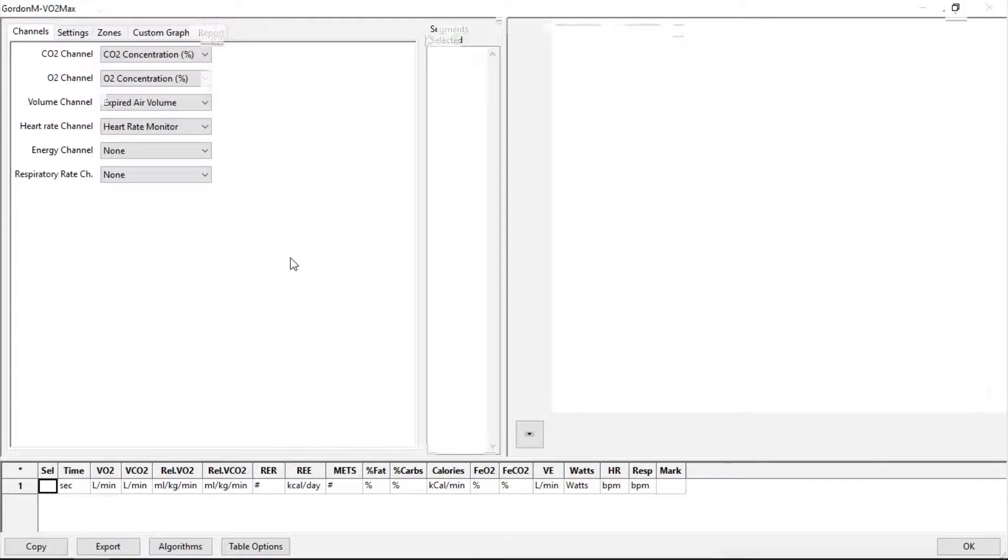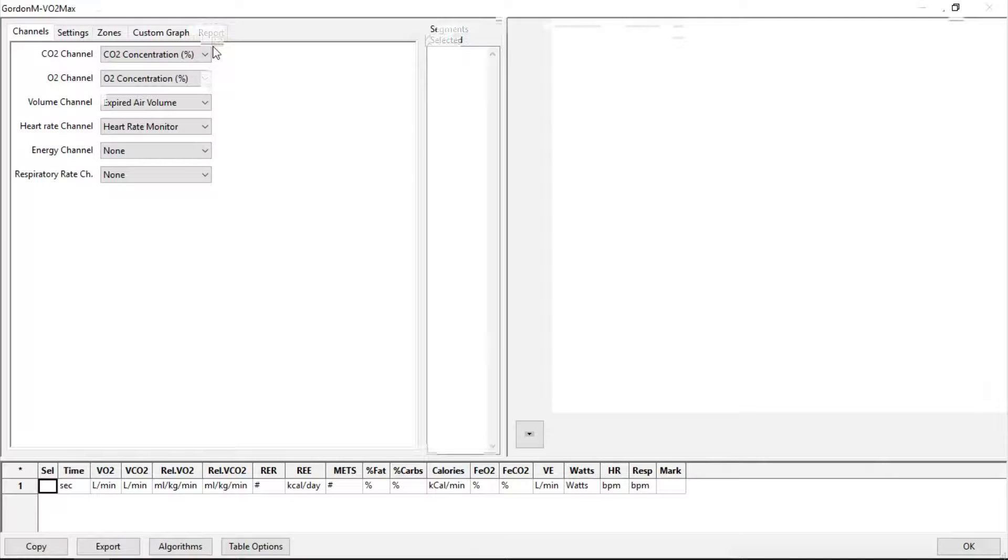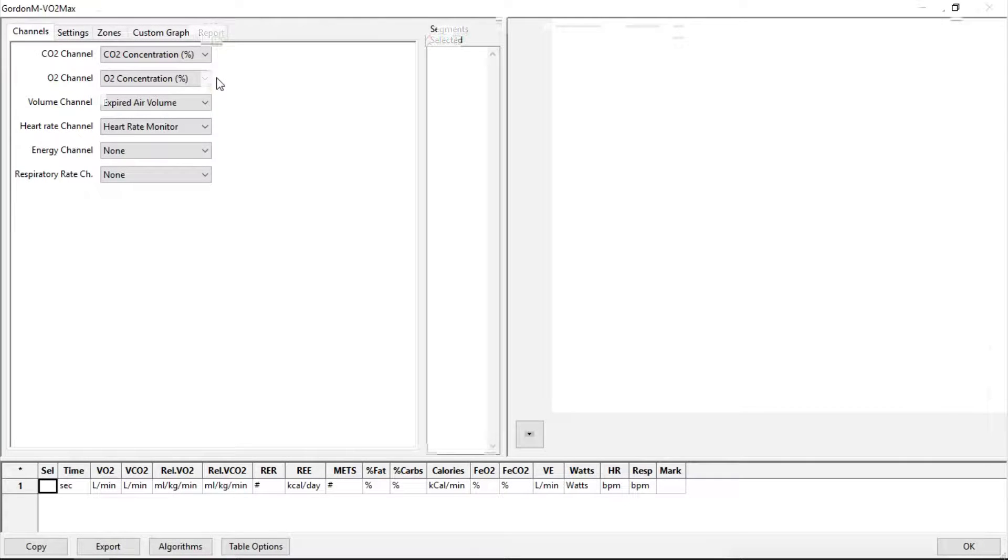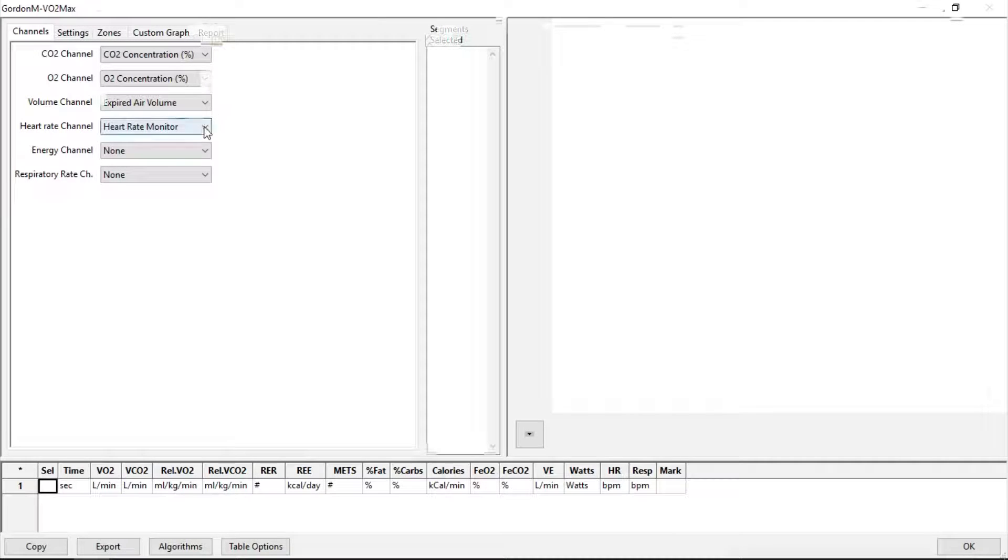In the window that comes up, make sure the CO2 channel is set to the CO2 concentration, O2 to the O2 concentration, volume channel to expired air, and change your heart rate channel to the heart rate.